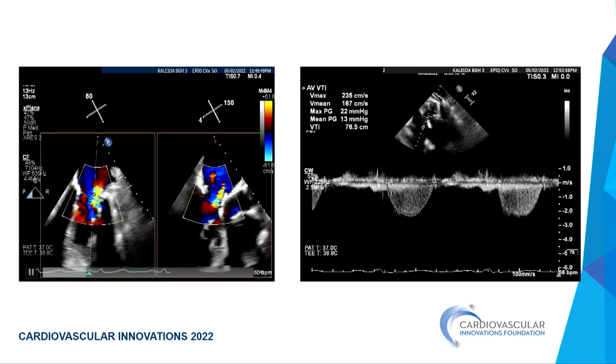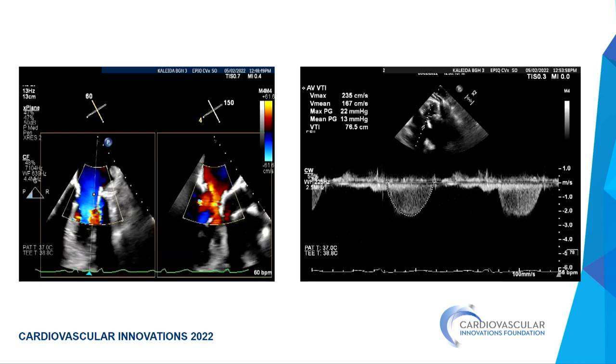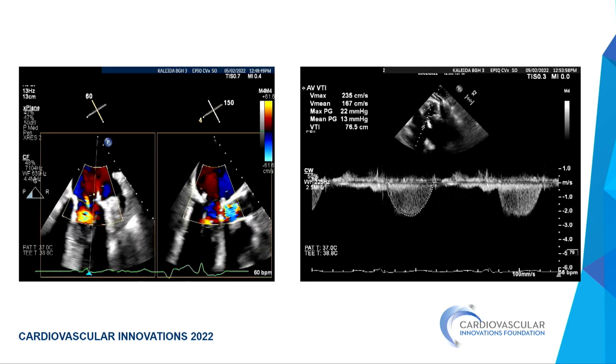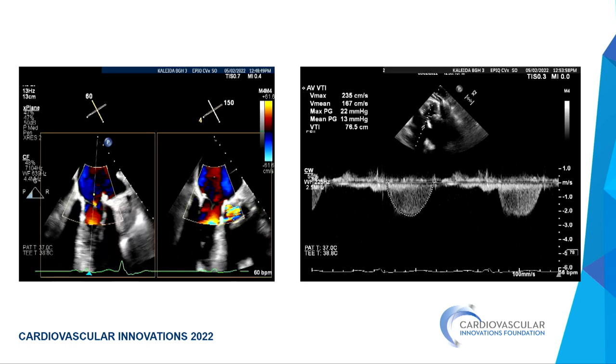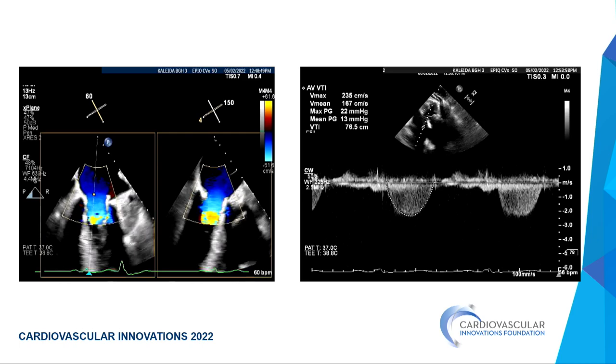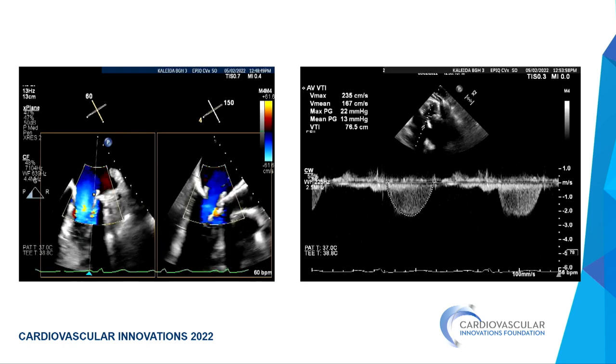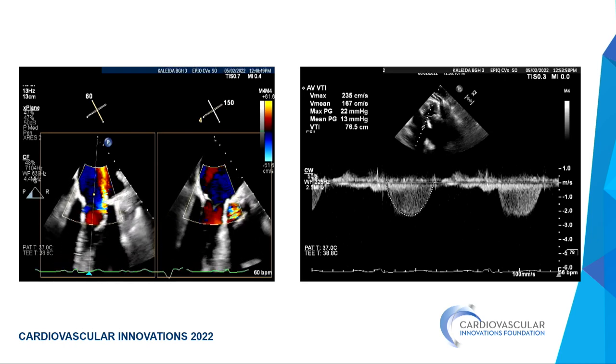So would you give Isopro? We did do a couple of challenges on the table. We kind of did tank up the patient. One of the things you always worry about at the end of anesthesia is you can see the LV cavity is small. Tank up the ventricle, spend some time, make sure you're actually getting a good gradient before you decide to move away from there, because we'd already cannulated the ECMO.